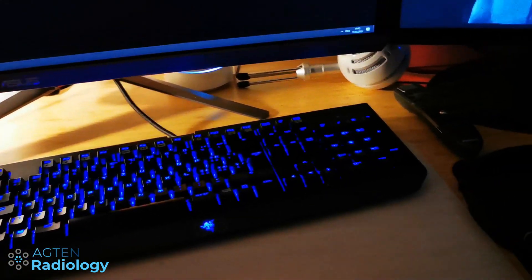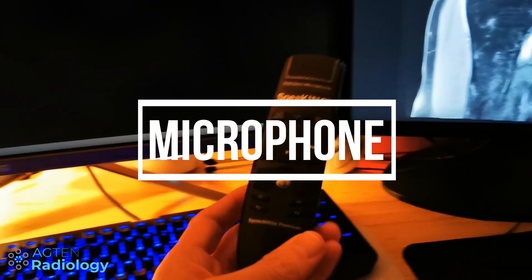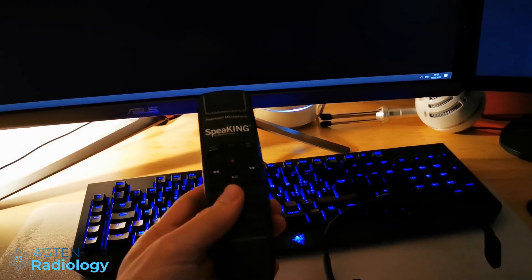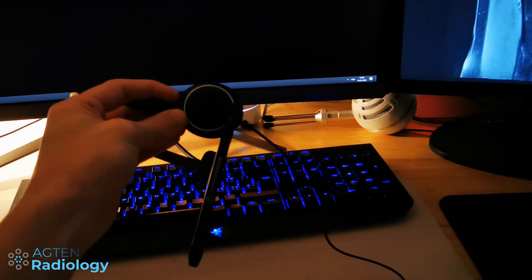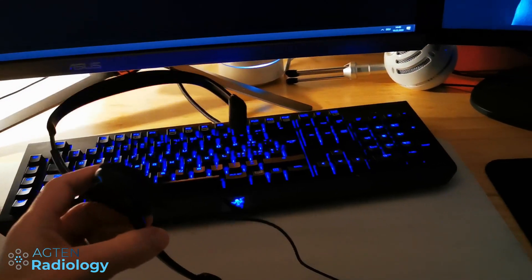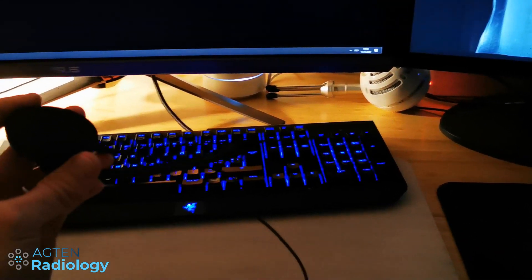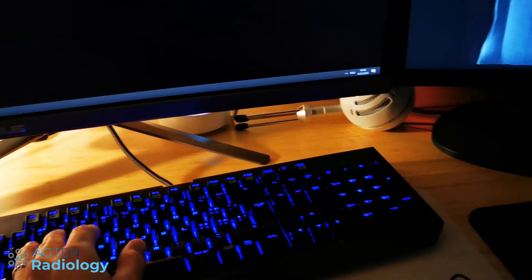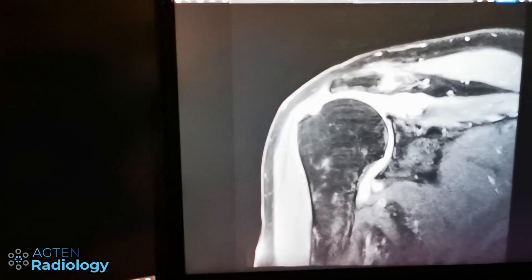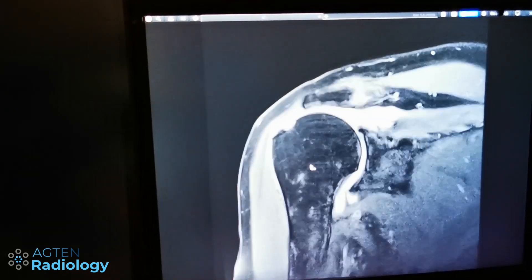Moving on to the peripherals — I have a fancy keyboard and mouse, and a normal mouse pad. For dictation, I don't use a dictaphone device; it's pointless to have one at home because you're in a quiet environment anyway. Don't buy one — they cost a few hundred dollars. A simple $25 headset like this one is sufficient. With the microphone always on, both hands stay free: one on the keyboard for PACS shortcuts and one on the mouse to navigate images.